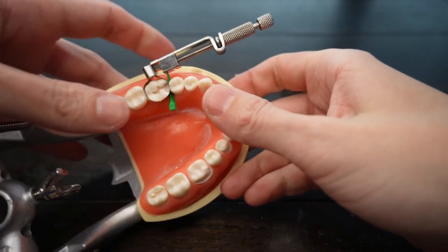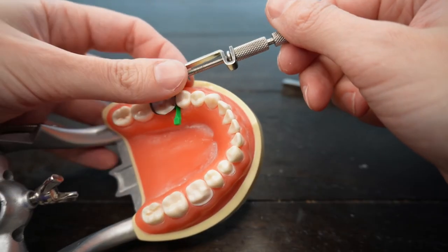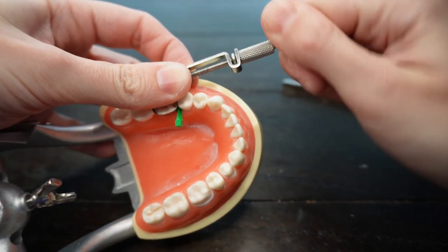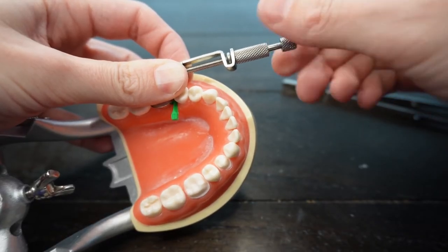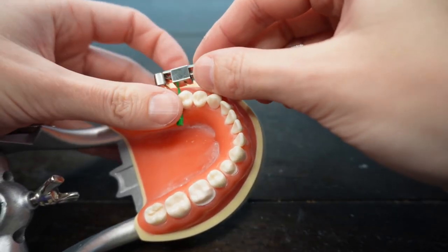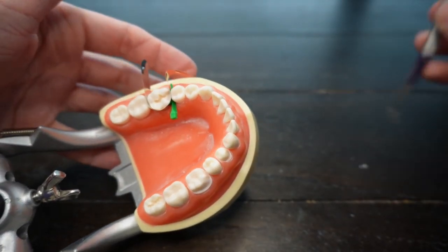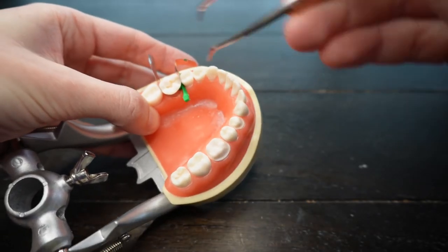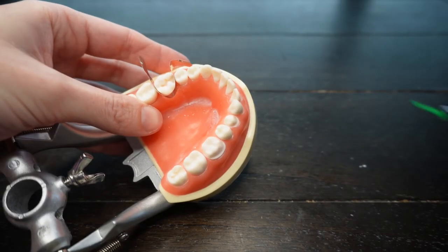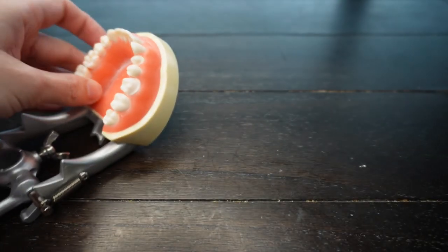Once you're done, you need first to unscrew this main screw. That way you will loosen the matrix band and you can take off the Tofflemire first. Once this is loose, you take it off. Then I would take the wedge off. And then I would gently take off the matrix band.